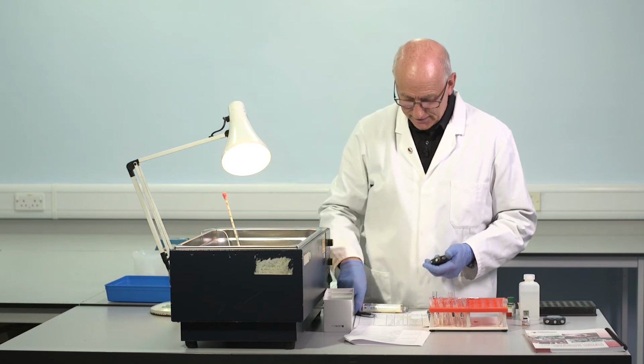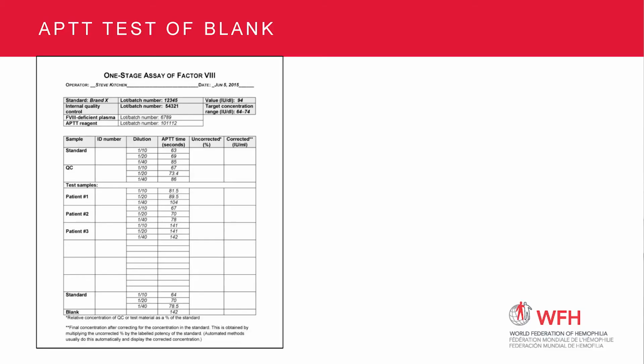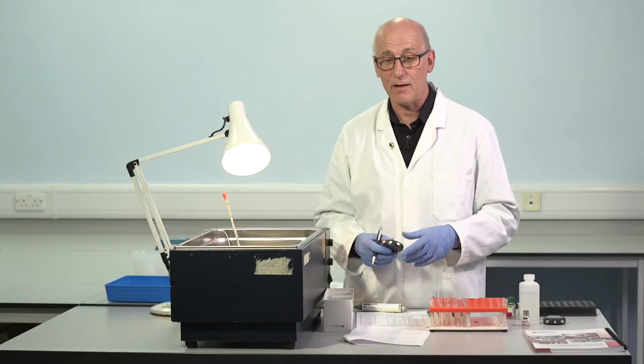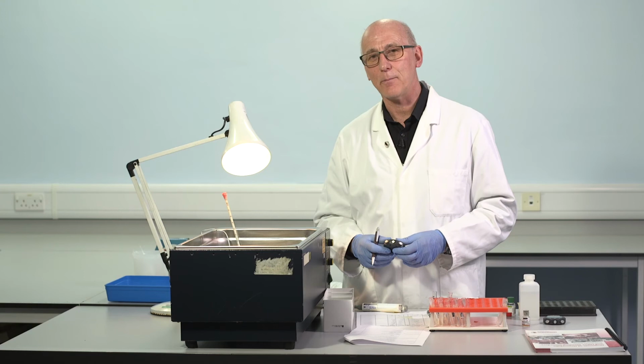So 142 seconds. And if you remember, that's very similar, almost identical to the times we obtained in one of the patients at different dilutions. So those clotting times are very similar to the blank time. The indication being that there is a very, very low level, probably no factor VIII present in that patient sample.